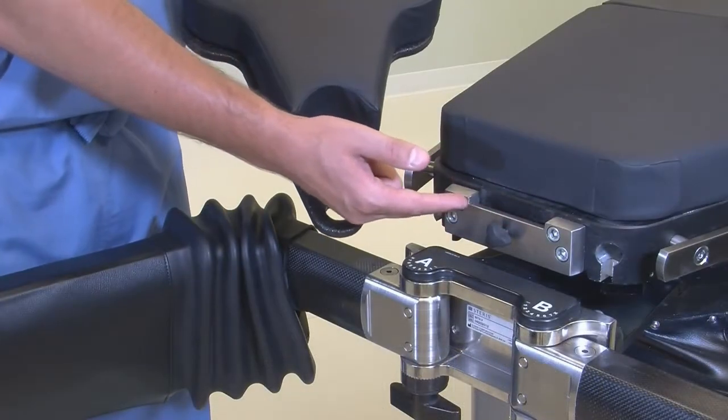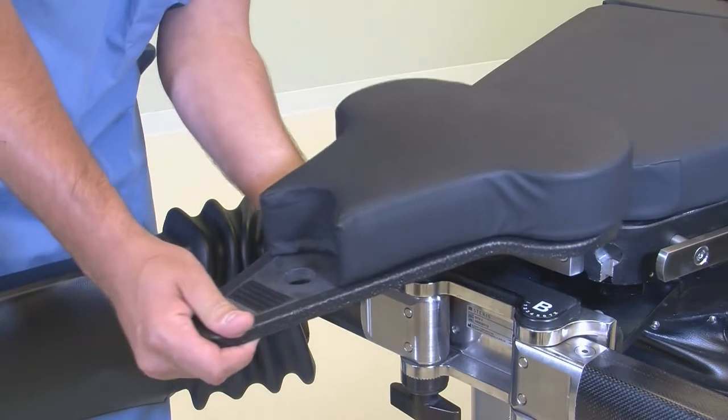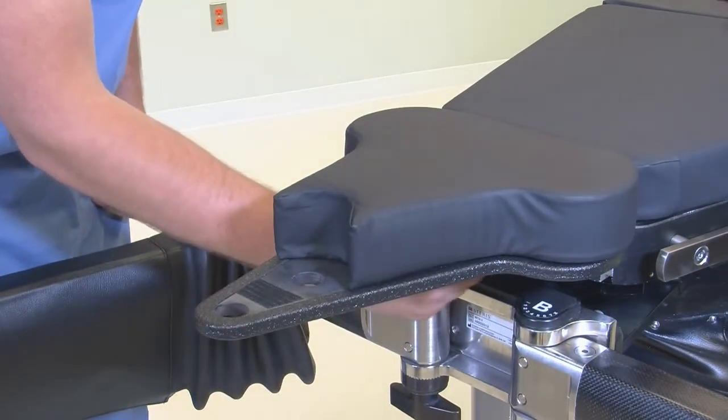Align sacrorest mounting posts with the slot in the OT1000 series as shown here, and tighten the knob.